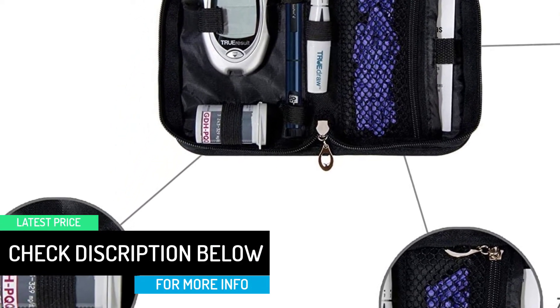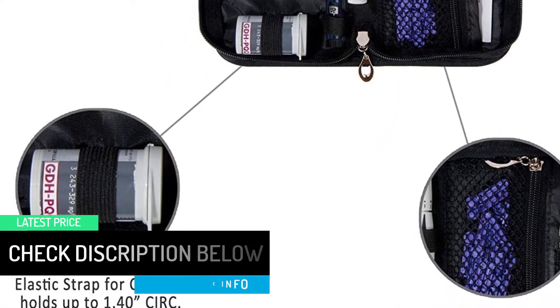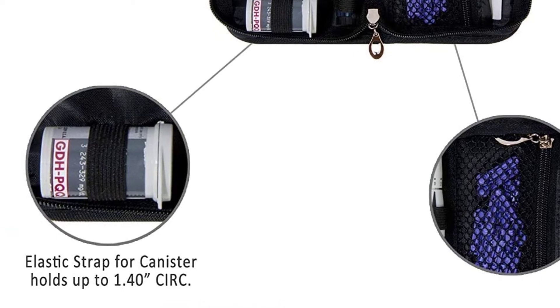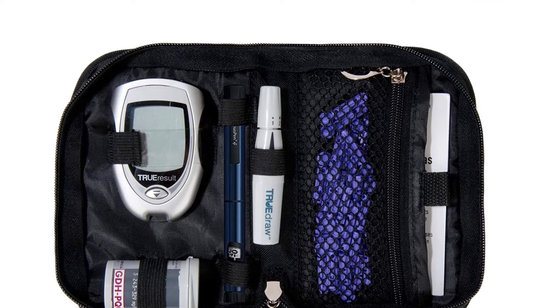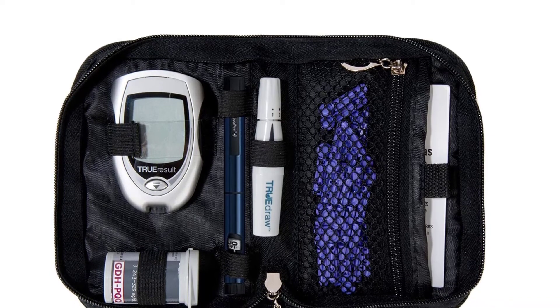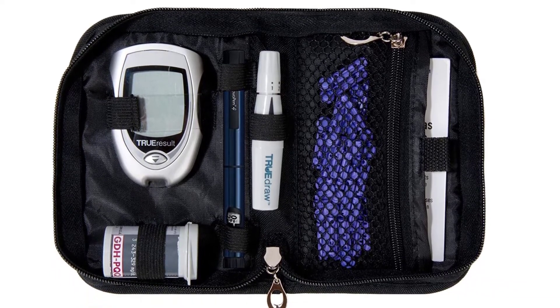Protective Blood Glucose Monitoring Systems Kits keep diabetic testing kits with you when outing, traveling, working and sporting. The Travel Glucometer Case fits a glucose monitoring system, blood sugar test strips, medication, pills, tablets, pens, swabs, and more.